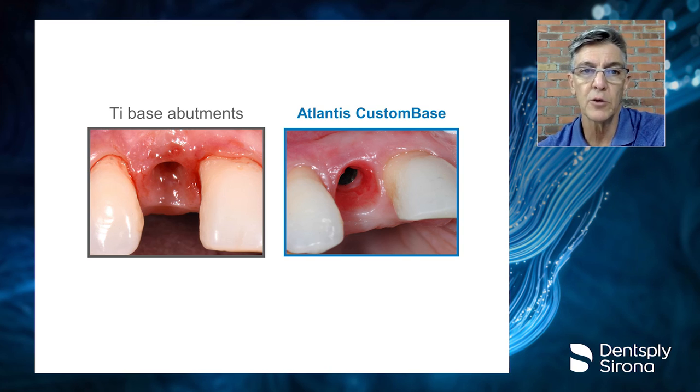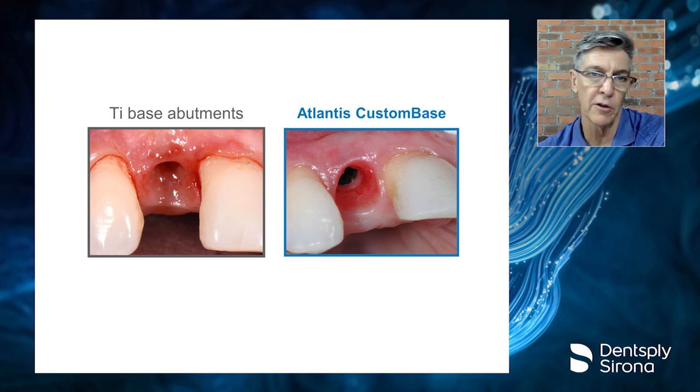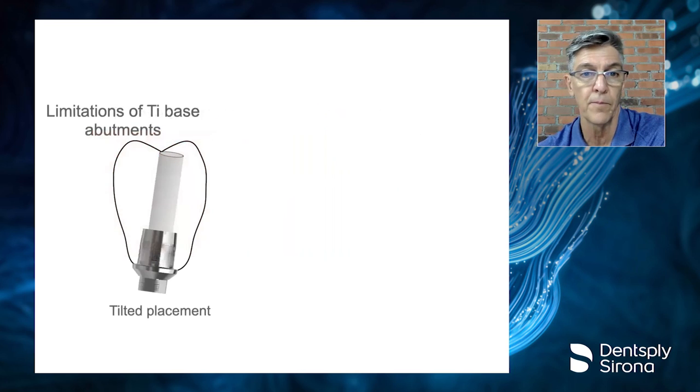It was simply squeezing the tissue beyond what it could handle. So I replaced it with a custom base. And this image on the right of the screen shows the tissue after a few weeks. I removed my restoration and took a photograph to show the change in the tissue health. It is much, much healthier and the patient's much more comfortable.